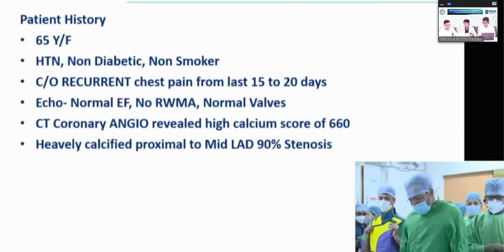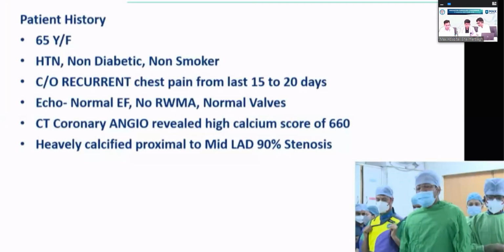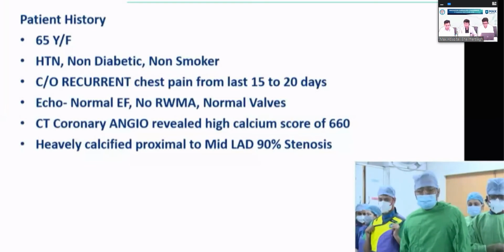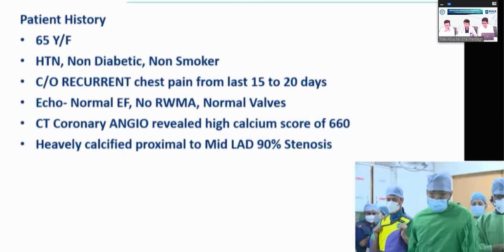The ECG shows no active ischemia. So we advised the patient to undergo a CT coronary angiogram. The first thing we find is a high calcium score, of more than 600. And then there is a dense calcified plaque in the proximal LAD causing almost 90% stenosis. So presuming that this is the cause of the patient's angina, and since the CT coronary angiogram is significantly positive for anatomical disease, we took the patient to the table and did a coronary angiogram.